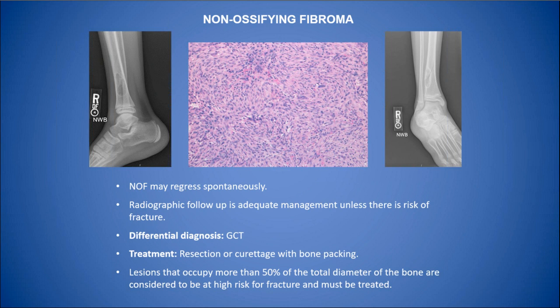as treatment. The differential diagnosis will be mostly with giant cell tumor of bone. Giant cell tumors of bone usually occur in skeletally mature individuals with closed growth plates and usually involve the epiphysis, not only the metaphysis. This is actually in the metaphysis going into the diaphysis. And if there is any problem, G34W would be helpful in confirming a giant cell tumor.